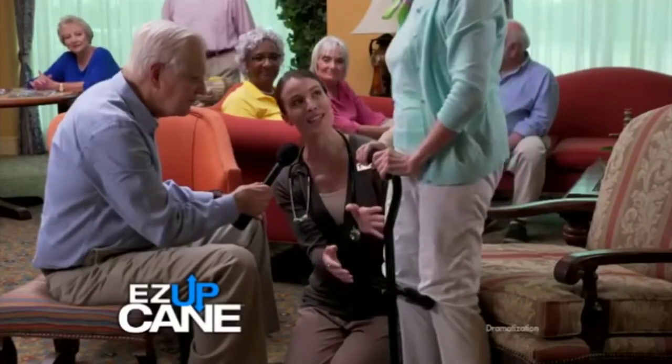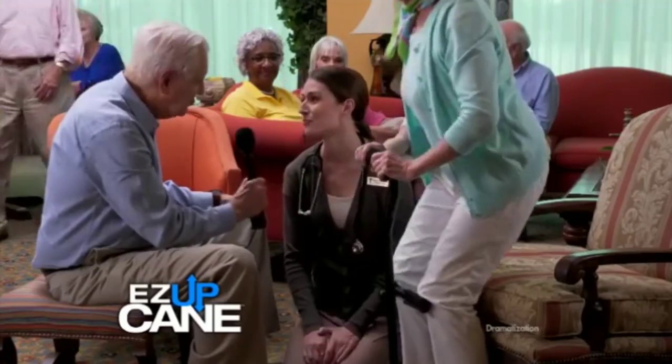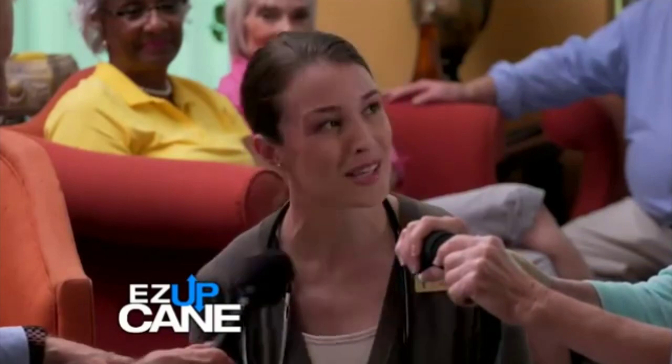The Easy Up Cane promotes a proper standing position and biomechanics. Would you recommend it? Absolutely. I've had patients who couldn't get up without my help and now they can do it on their own.